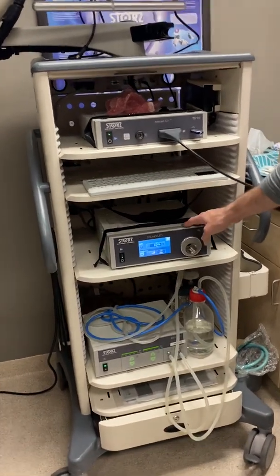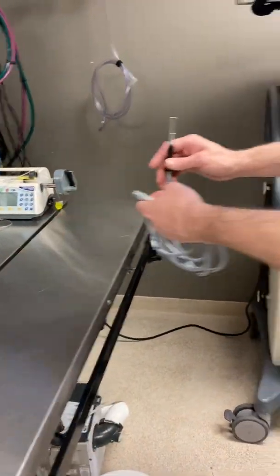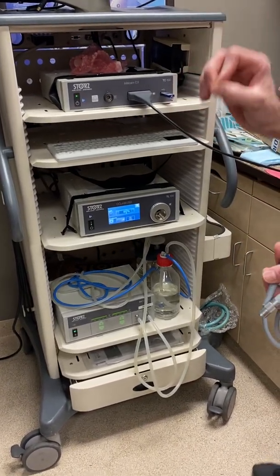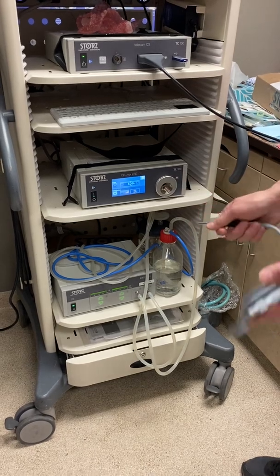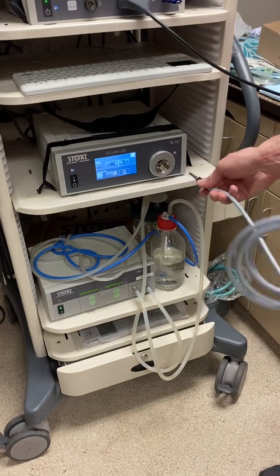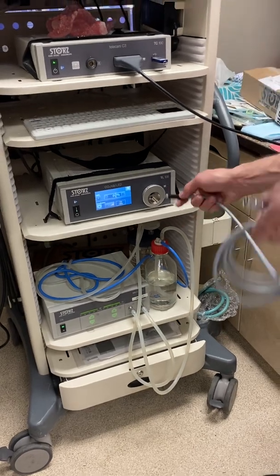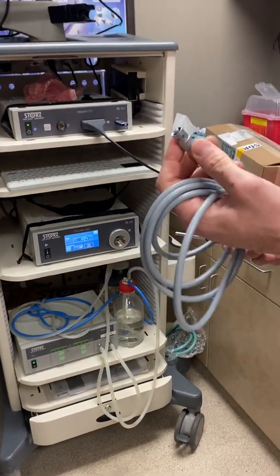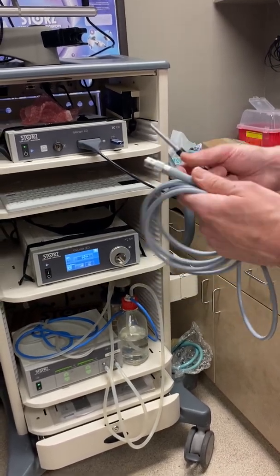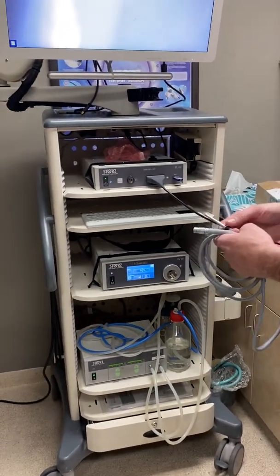For the second box — the light source — you need one additional piece: a small round black adapter that plugs right into the light source. Then plug in the light cable into that black adapter, and the other end of the light cable connects to the post on the side of whichever scope you're using — otoscope, lap scope, whatever scope. There will be a little T on the side of the scope and you just twist it in.